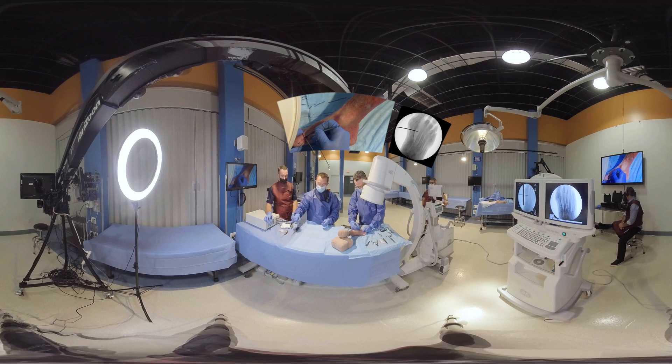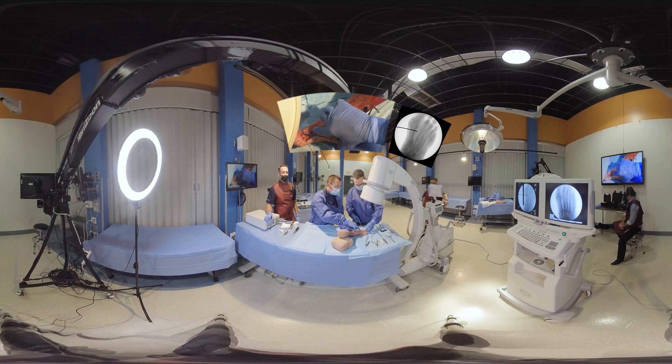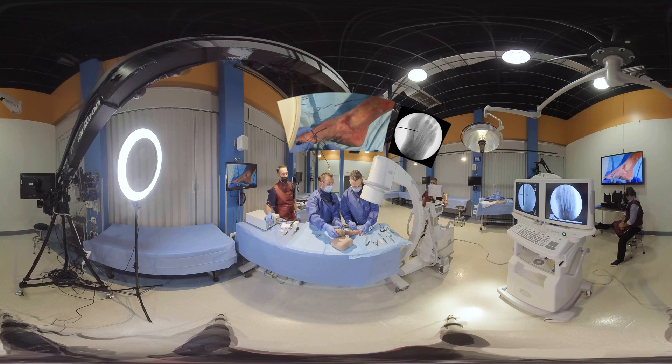This is half above the wire, half below the wire. I'm making it a little bit larger for demonstration purposes. But as you get more accomplished, wouldn't you agree, Dr. Campbell, you can make this smaller and smaller?